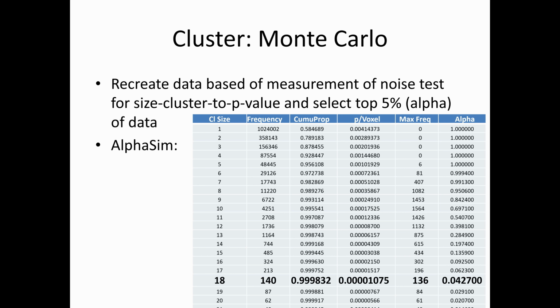And you look to see if you threshold that value at 0.05, say, and you can change your threshold value at the voxel level, then this one is actually threshold at 0.001. So if you threshold your voxel level, how many times do you get a cluster of a certain size in your data if you do 10,000 permutations?